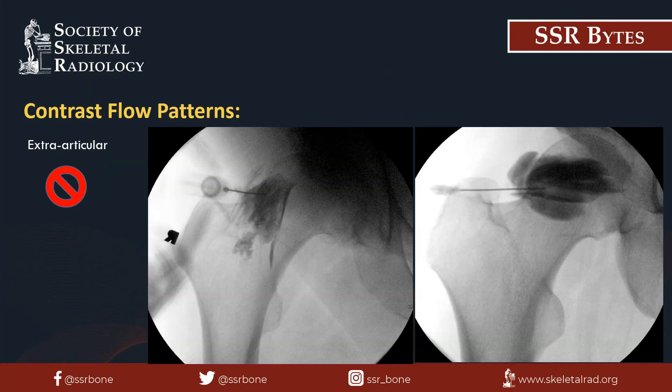Here are some examples of abnormal flow patterns where the contrast pools at the tip of the needle. If you see this, it is highly unlikely that the needle is within the joint space. The needle may be embedded in the joint capsule or may be completely extra-articular, possibly within the adjacent musculature or soft tissues. Resistance may be felt when trying to inject contrast compared with intra-articular injections, raising your awareness that you may not be in the joint.